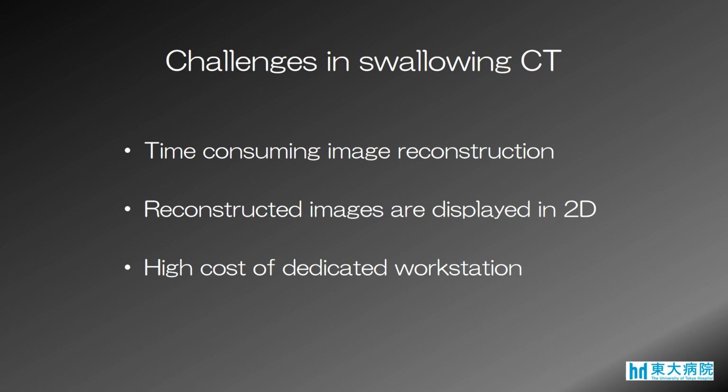However, it is not all good. There are also some challenges. It takes a relatively long time for image reconstruction. Despite that, reconstructed images are displayed in 2D. The cost of a dedicated workstation is so high.